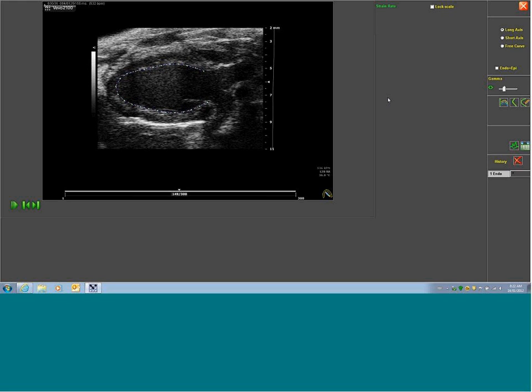So the next portion of the analysis you'll want to do is now select your epicardial trace. And this is done by selecting the endo-epi option that is over at the right-hand corner. So once you select that, automatically the epicardium trace is going to be placed. Now, if you want to increase or decrease the placements of these points, this can be done with the green arrows here.